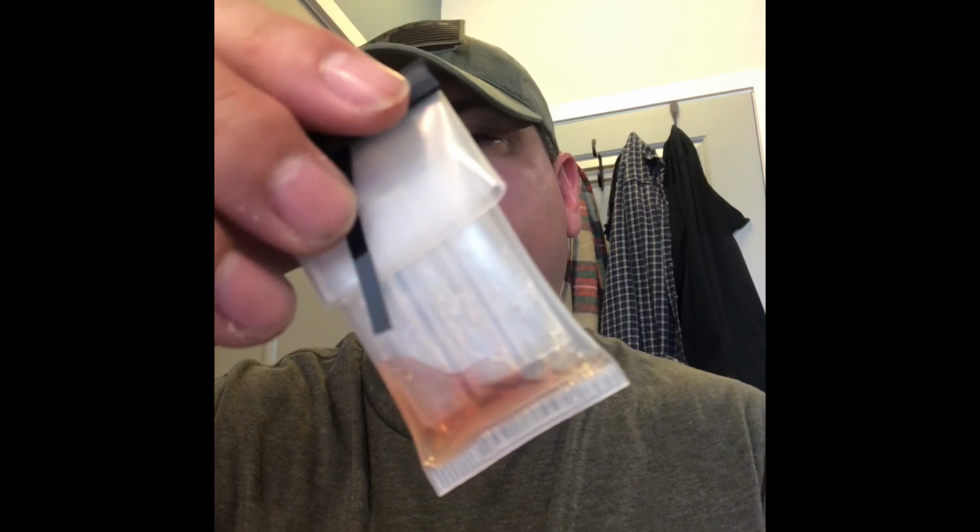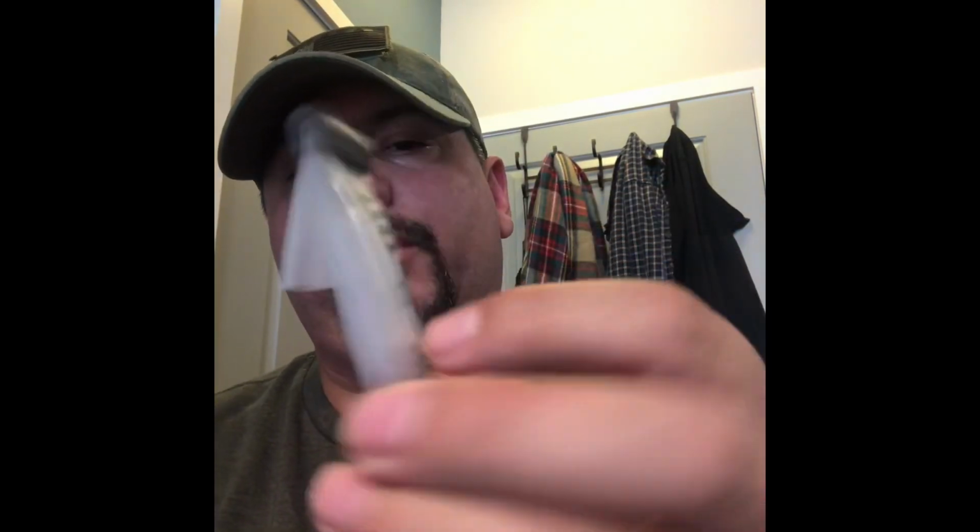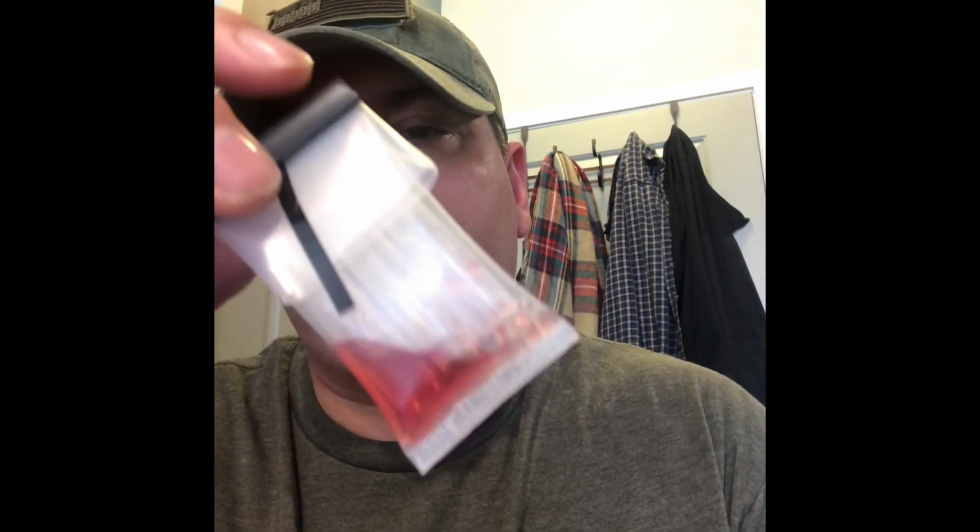It is turning a different color. It is turning a purplish pink color. But again, there's nothing in there. We wouldn't go out there on scene and say, we're going to test nothing, and now you're going to jail. There's nothing to test. It doesn't matter, because the center ampule was already orange-ish. It turned purple when the third ampule was broken. I wouldn't call that a positive, obviously, in any event, because there is no substance in there.